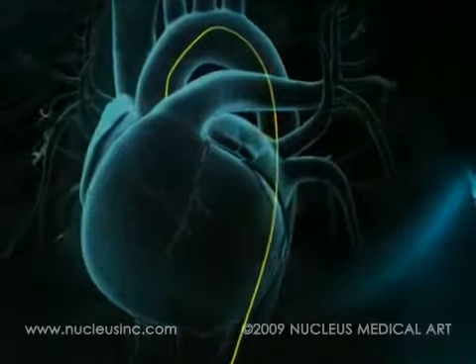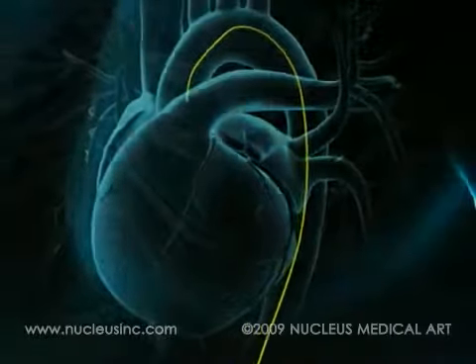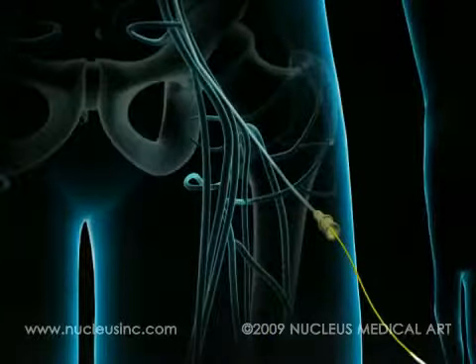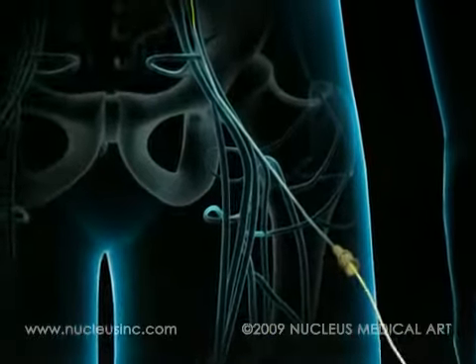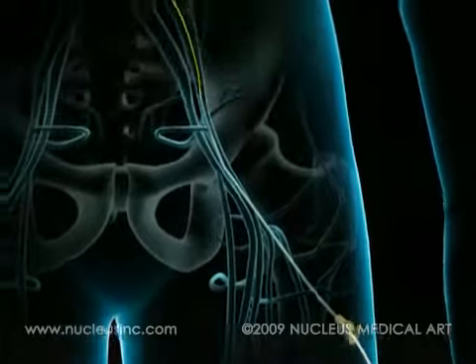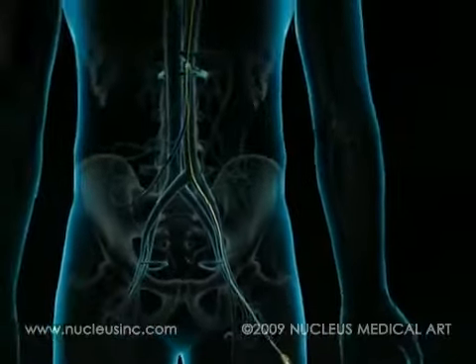to your femoral artery. At this point, you will be given a blood thinner to reduce the risk of blood clots. Next, a soft, flexible catheter is slipped over the wire and threaded up to the heart. The procedure is monitored using a continuous X-ray imaging device called a fluoroscope.